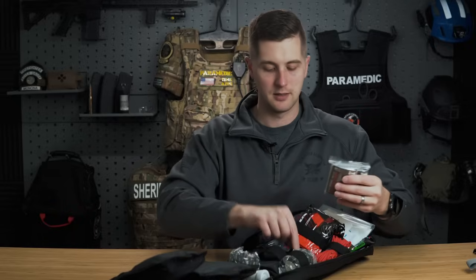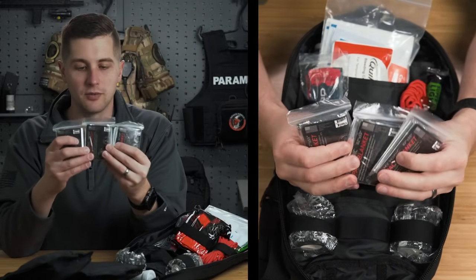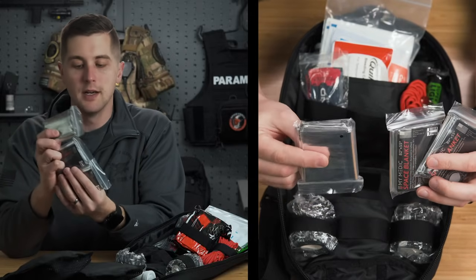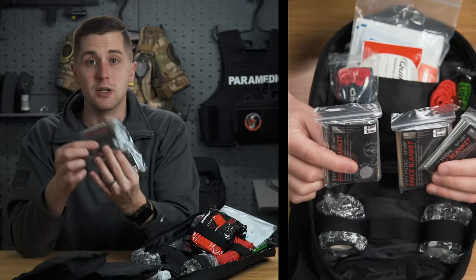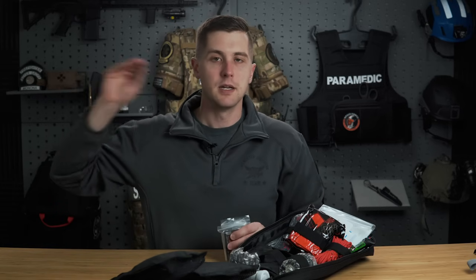And this, like we were just talking about hypothermia, these are three survival blankets. So these are space blankets, they're their brand. And what these are basically meant to do is reflect heat in, keep cold out. The best thing you can do with a trauma patient is keep them warm. Hypothermia kills in trauma. Even if it's 95 degrees outside, they lose the ability to regulate their temperature.